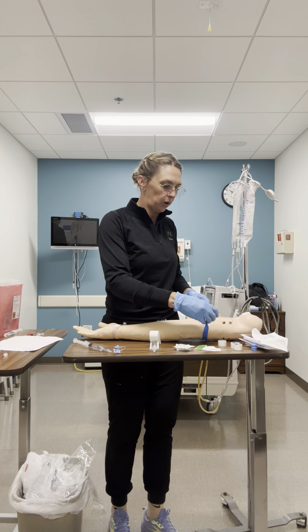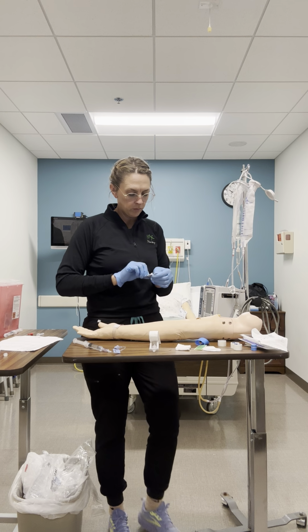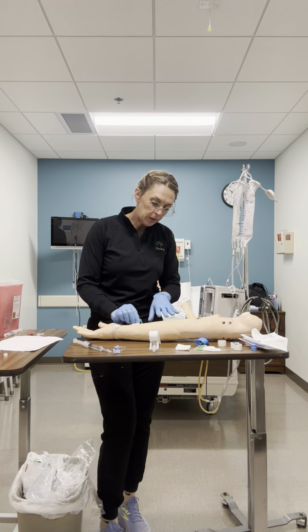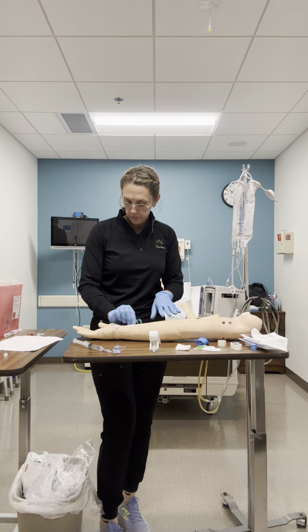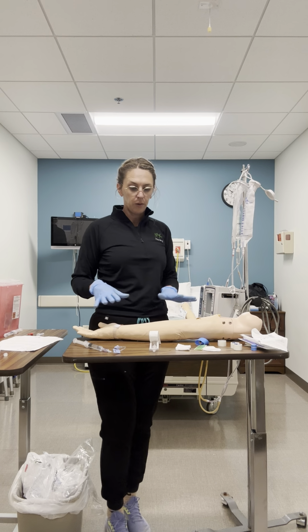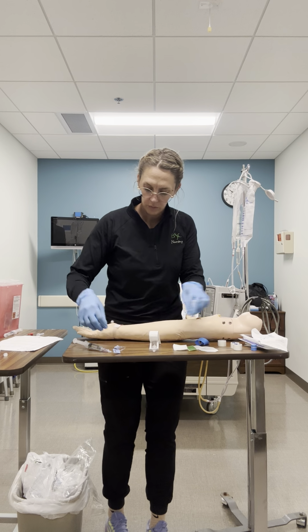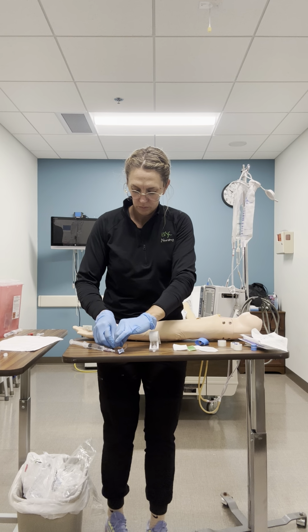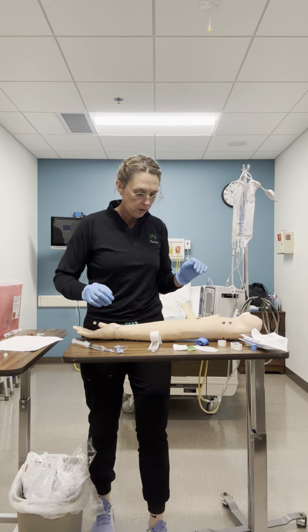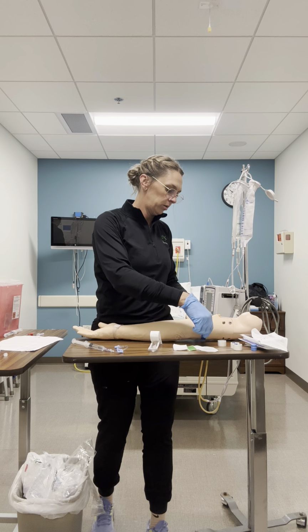I'm gonna release that tourniquet. And the alcohol. We're gonna clean the area. Then we're gonna allow that area to dry completely before we do anything else. Just loosening that lid. Okay. So area is completely dry.